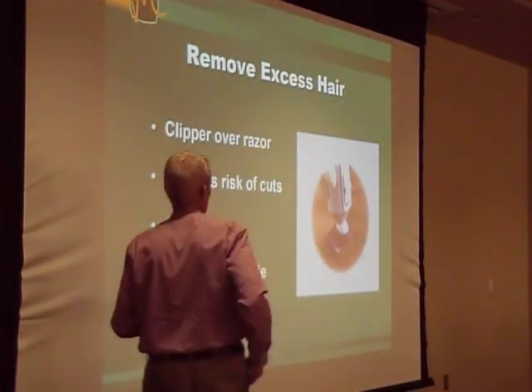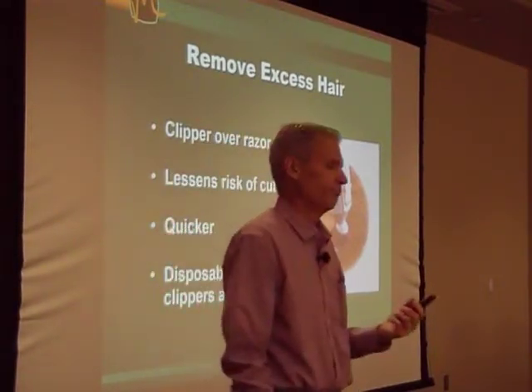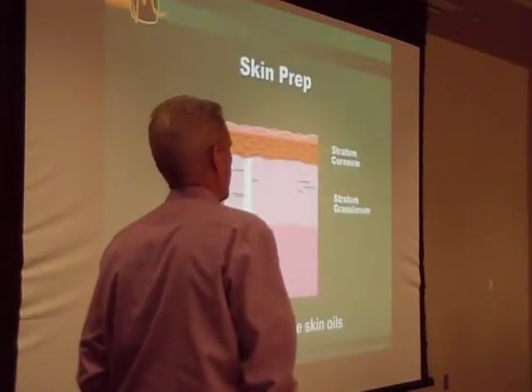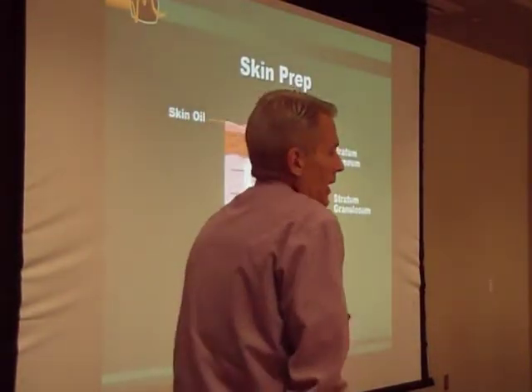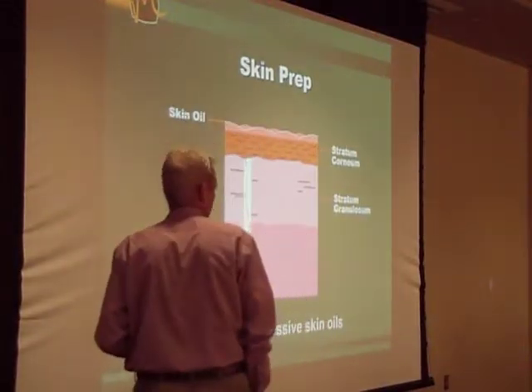So when it comes to removing hair, there are nice devices out there, rechargeable clippers with disposable heads. And again, you don't have to shave the whole chest, just the area where the patch is going to go. And then skin prep is vitally important.